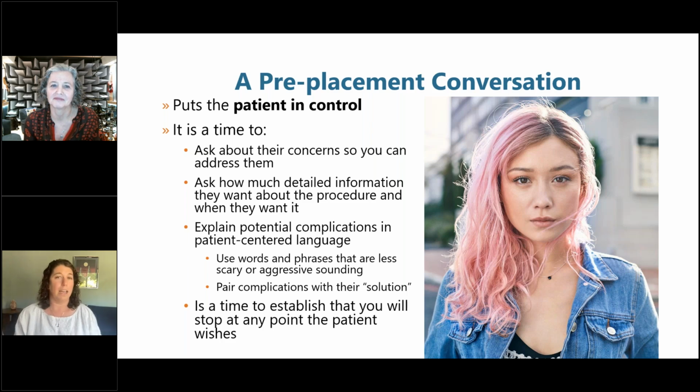We just kind of take a pause, we check in, we take a little break and then regroup. And if the client wants to move forward, then we move forward. And then out, if the client just says out, that means I am fully done with this procedure. I do not want to keep going, and I would like all the instruments removed.